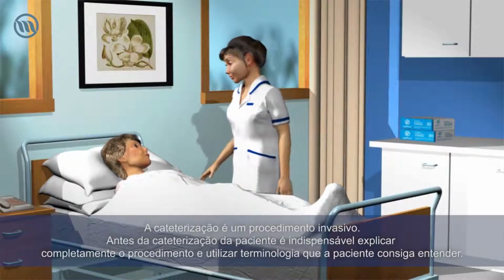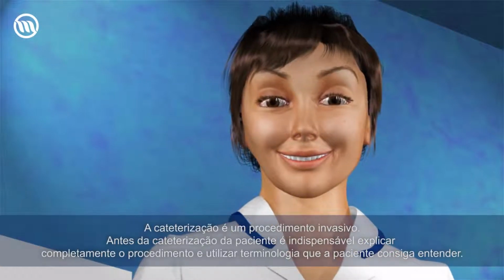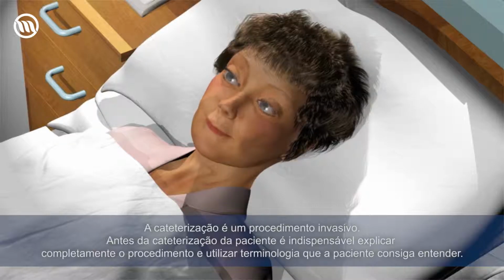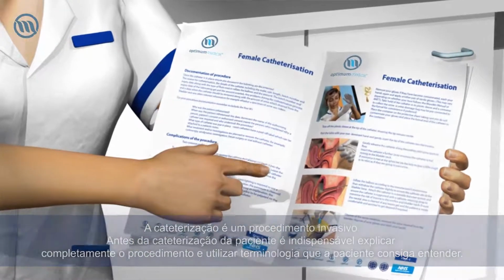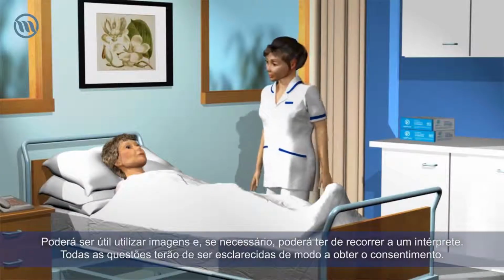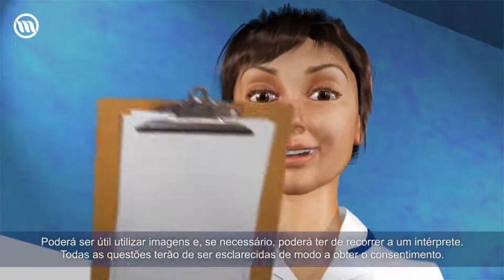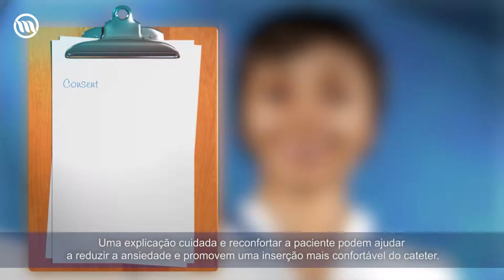Catheterization is an invasive procedure. Prior to catheterizing a patient, it is imperative that a full explanation of the procedure is provided, using terminology which the patient can understand. Using pictures can be helpful, and if necessary, an interpreter may need to be involved. Any questions must be answered and informed consent gained. A clear explanation and reassurance can help to reduce anxiety and enable a more comfortable insertion of the catheter.